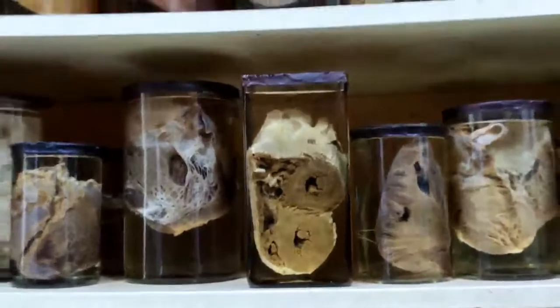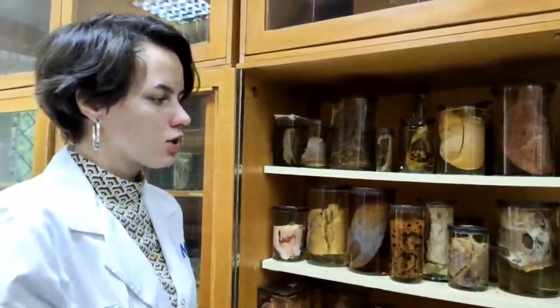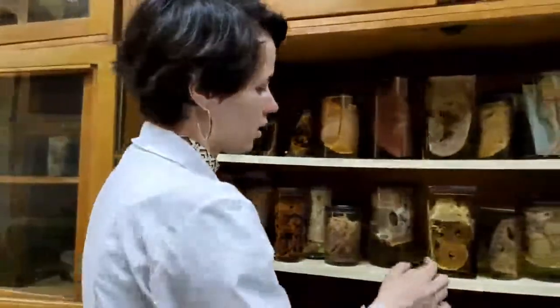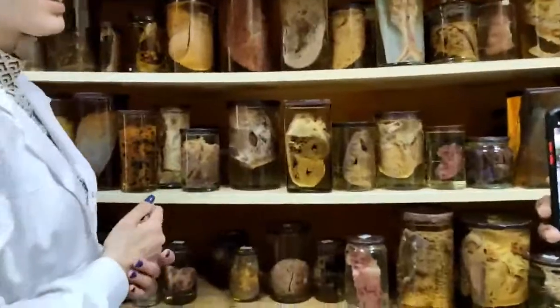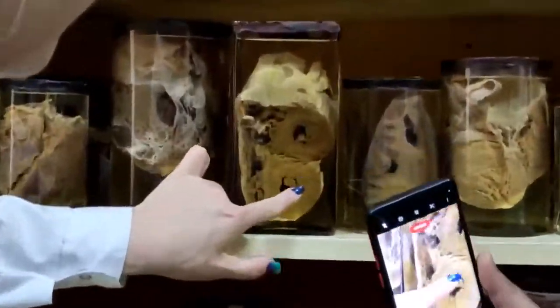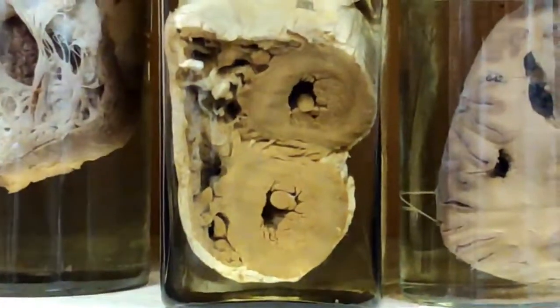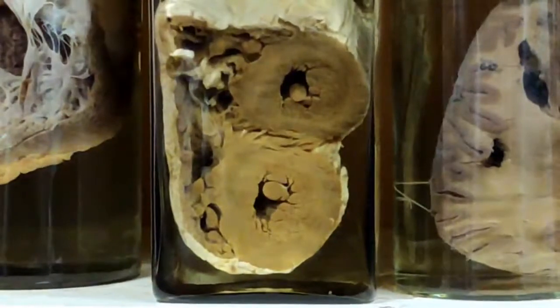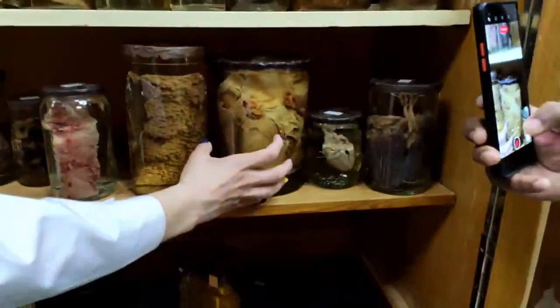Concentric means that this patient still has compensation of the heart function, and we can see that the thickness of the wall is enlarged. Normal thickness is up to 1 centimeter, and here we can see at least 1.5. And when this condition progresses, we can see eccentric hypertrophy of the heart, it will be like this. Can you see the difference?